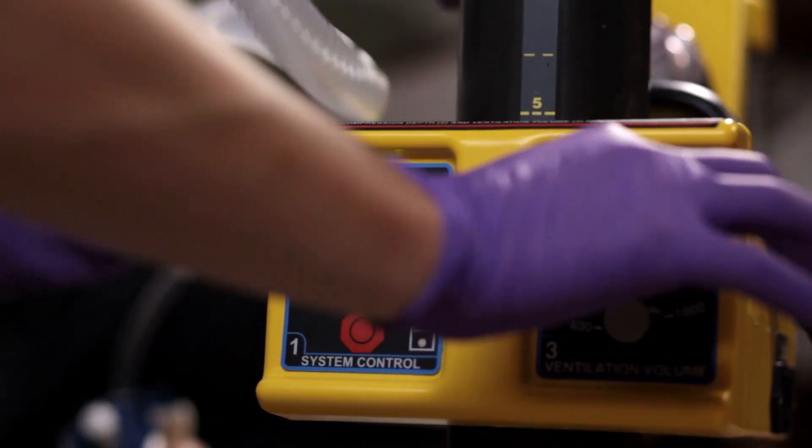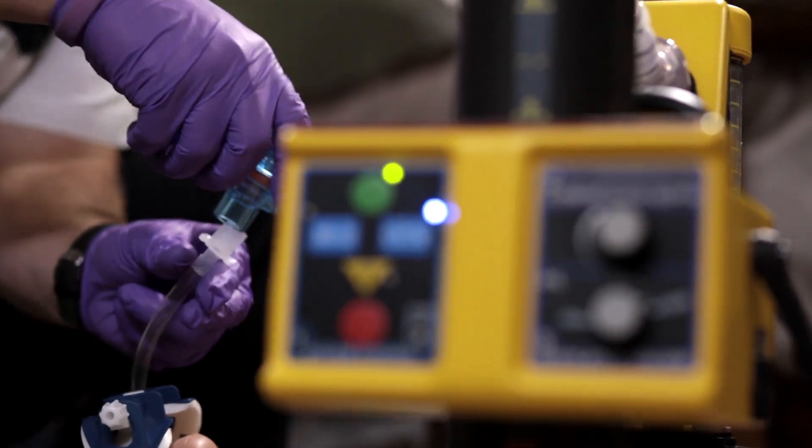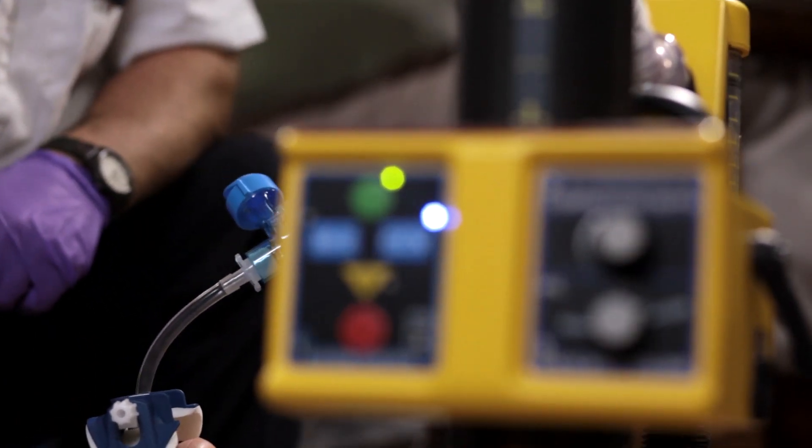Once the paramedic presses the start button in mode of operation, the compression depth and ventilation volume are dialed in. The ventilation hose connects to the paramedic's existing patient airway.